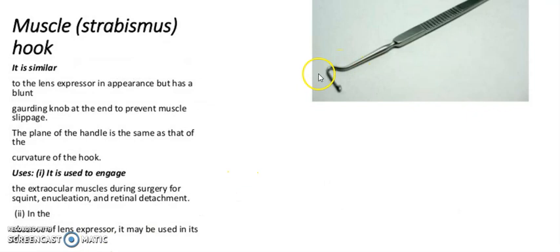It is a muscle hook, also known as a strabismus hook. It is similar to the lens expressor in appearance but has a blunt guarding knob at the end to prevent muscle slippage. The plane of the handle is the same as that of the curvature of the hook. It is used to engage the extraocular muscle during squint surgery for recession, resection, and retinal detachment operations. In the absence of a lens expressor, it may be used in its place.